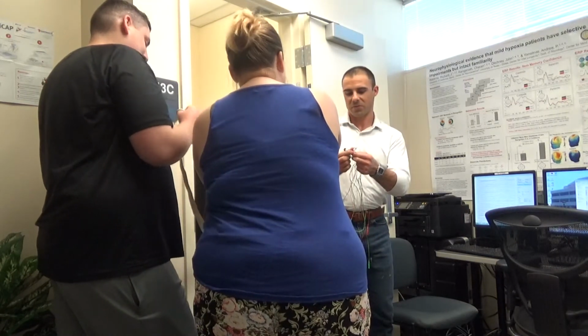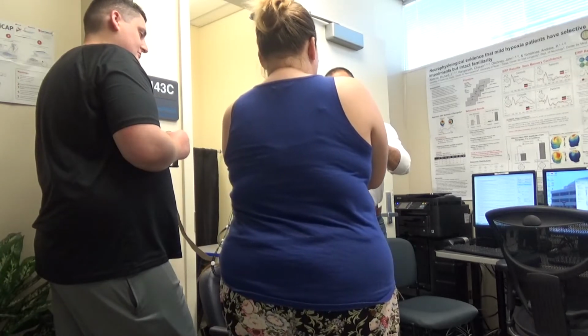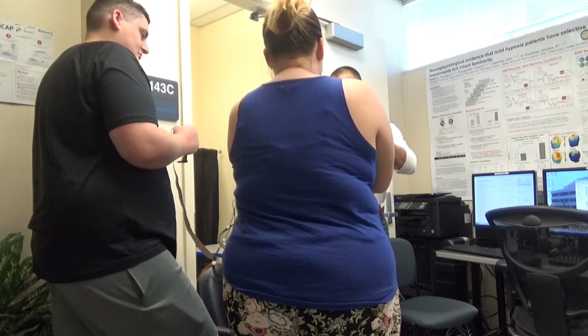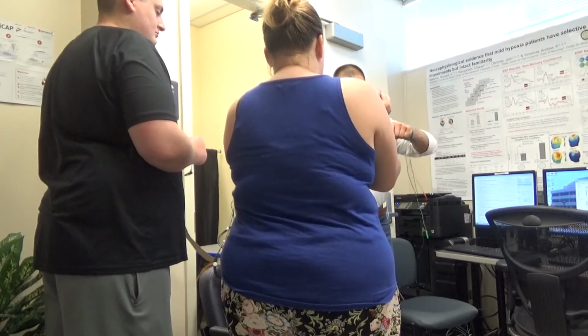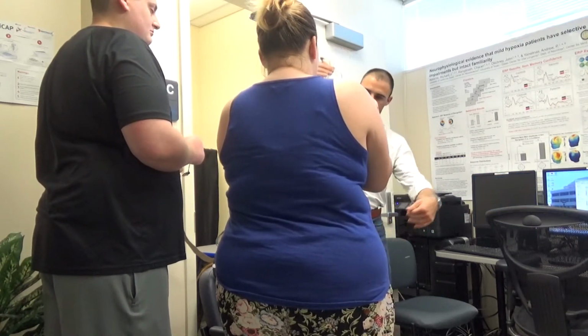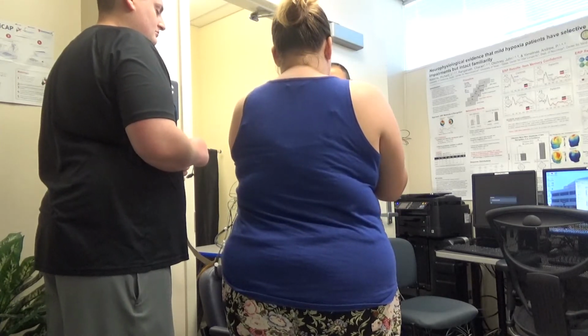So okay, I was gonna ask for your help. If you could hold these, gently take these stickers off, put the stickers in the garbage behind Ryan, and just hold the electrodes separate. So, yeah, sort of like this. Put that there. So kind of hold this in that hand, and those there.